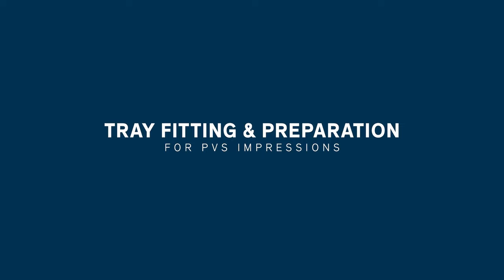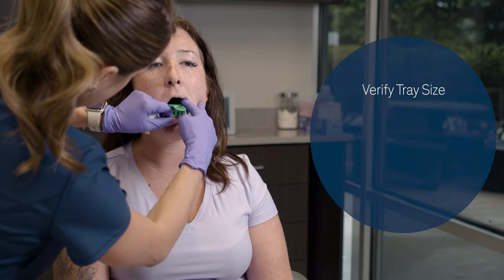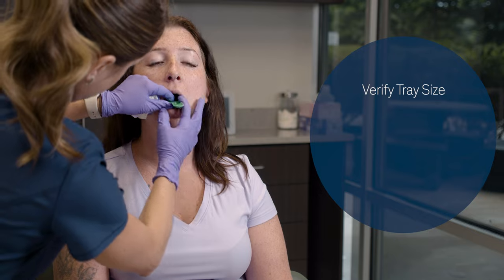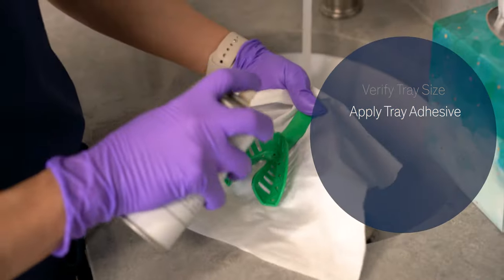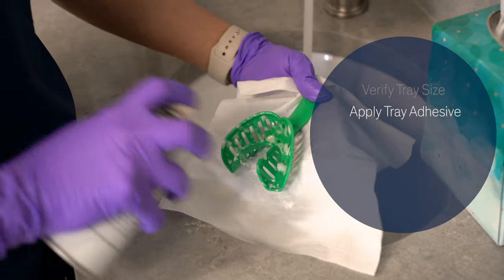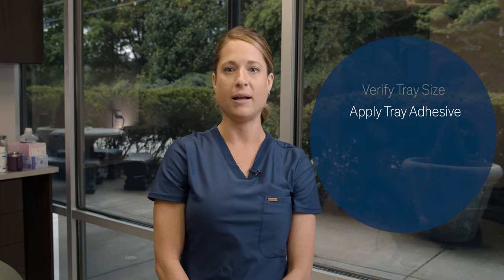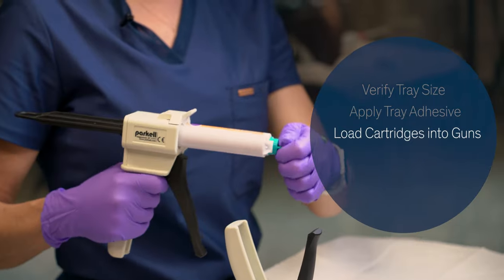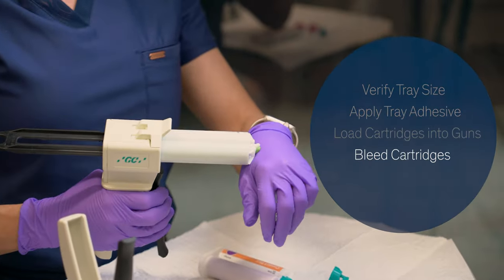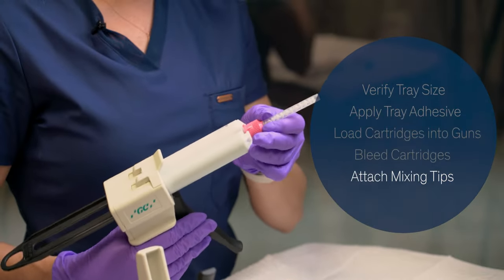You'll want to try in your disposable full arch upper and lower tray to verify the correct size impression tray that you'll use. You'll then paint the impression trays with a tray adhesive. Before loading the impression tray with the PVS material, go ahead and load both light body and heavy body cartridges into their guns. Bleed both cartridges before placing the mixing tip applicators onto the cartridges.